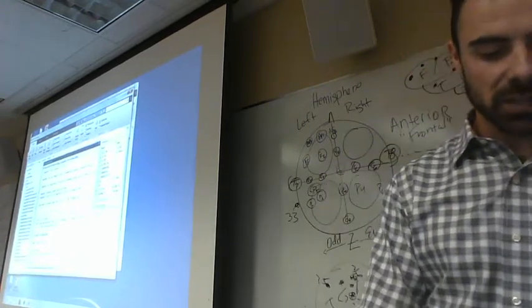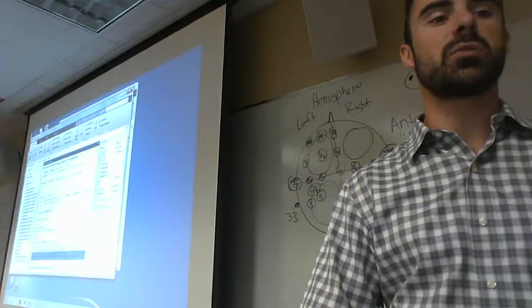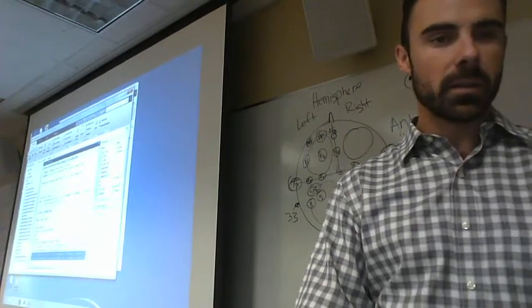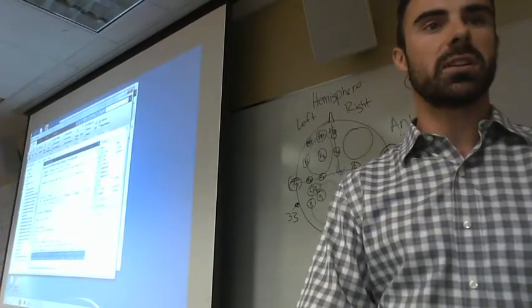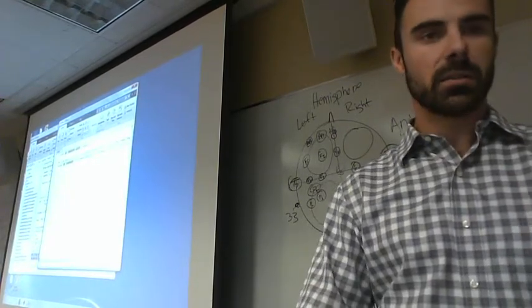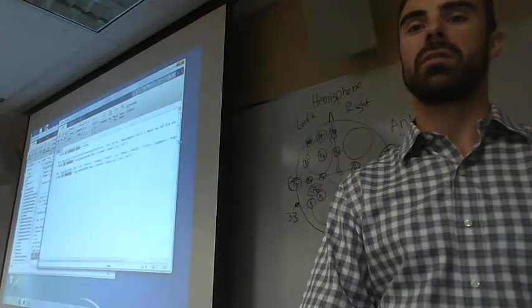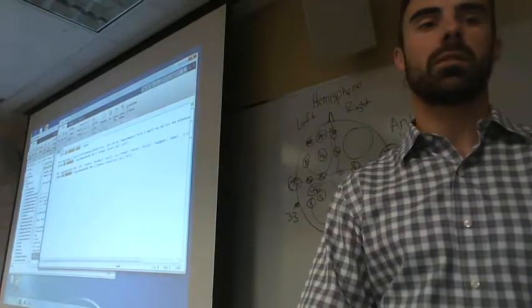Let's type EEGH in again. Okay, and we can highlight these bottom 2 lines, which are the new lines that we've added. I copy that with Control C. I come back to our editor. I press Enter to give it a space. Control V to paste. Okay, and we can start to see everything that we've been doing.